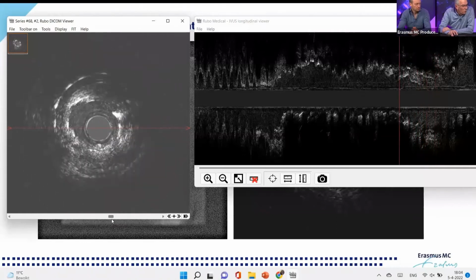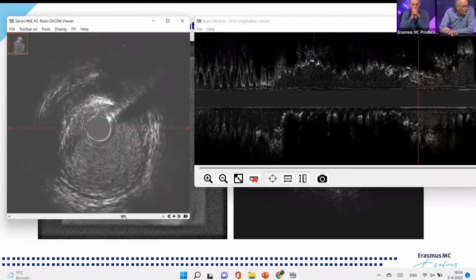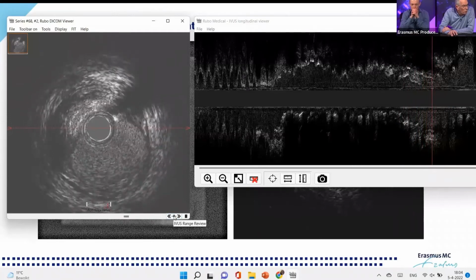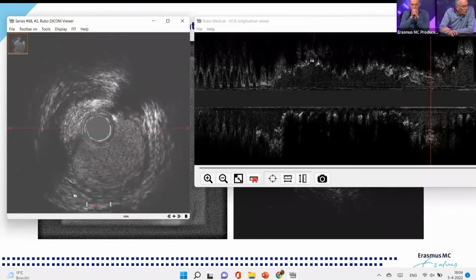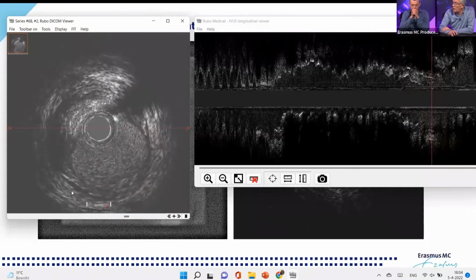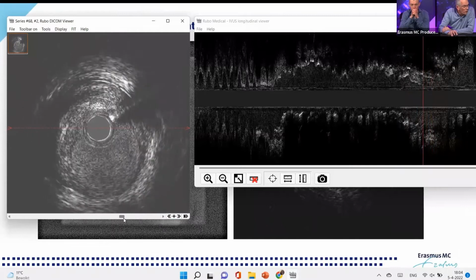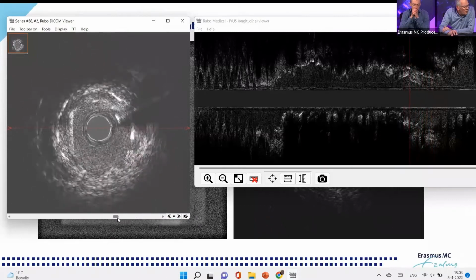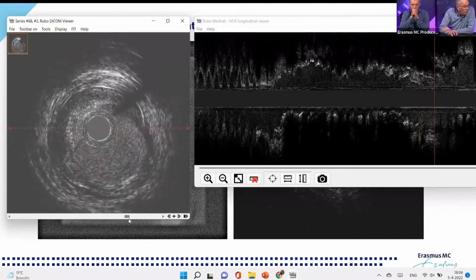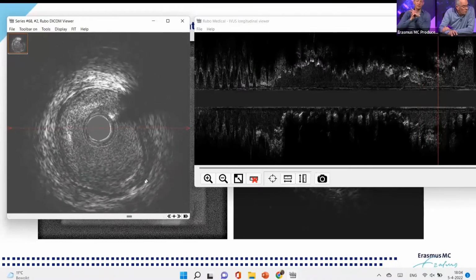Yeah, then we have proximal from the old stent, because remember we did balloon dilatations. Then we see here something that often needs a little bit more practice. You see here some blood flow behind the media, indicating a submedial dissection in there. Either the dissection was there, or I was looking for whether we made an edge dissection, but I think this dissection was made by the ballooning in there. And of course you can choose to cover that. And this is actually very interesting.